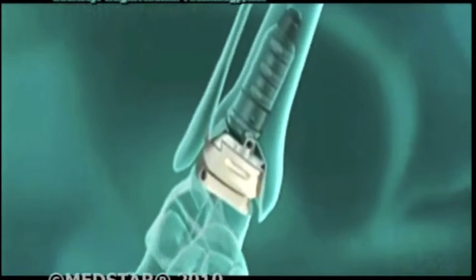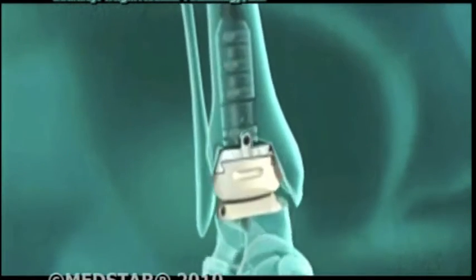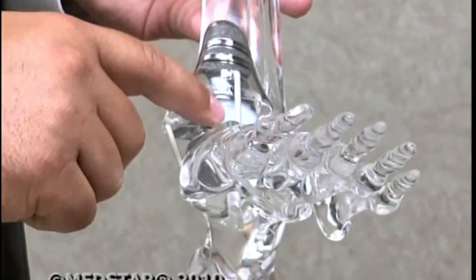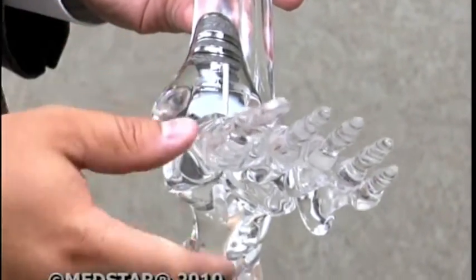Good thing, because the new in-bone total ankle implant was just around the corner. One of the most exciting things about the implant is the fact that we have something called a modular stem. Dr. Steven Brigido says the stem is unique because it allows him to customize the implant to fit the patient.